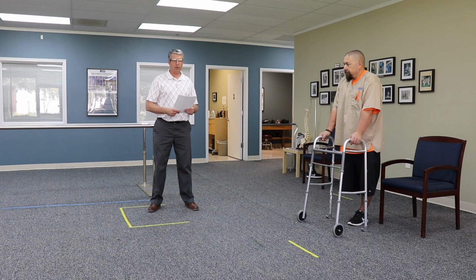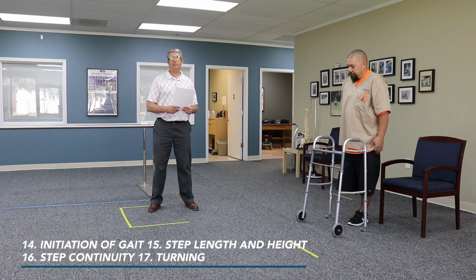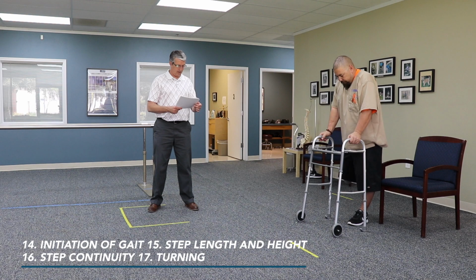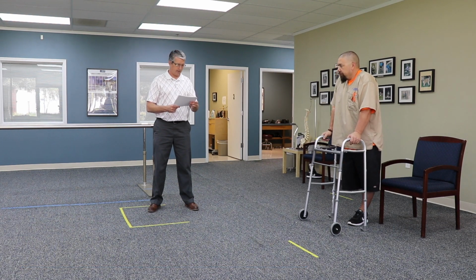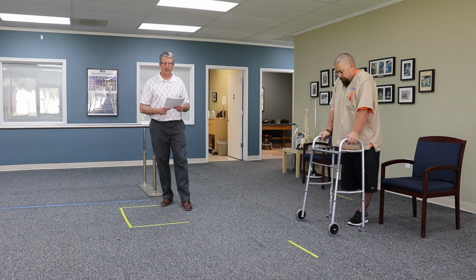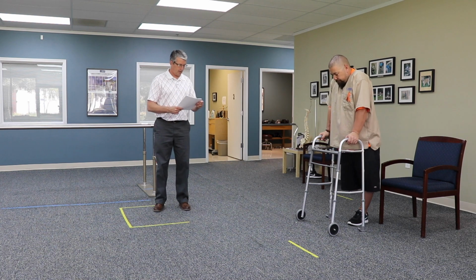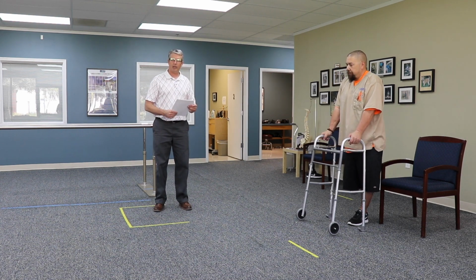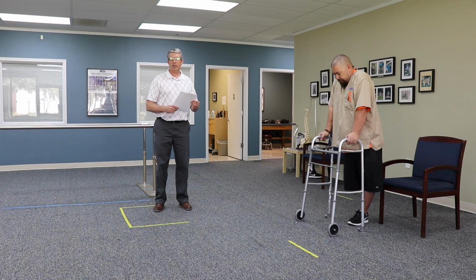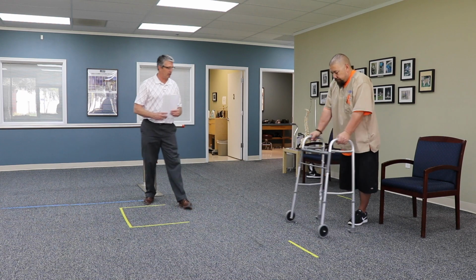Okay, we're now at that point where we're going to get the initiation of gait going. So that's number 14, 15, 16, 17 on the list of tasks. So initiation of gait. Yes, you can do this test without a prosthesis on. Obviously, they're going to need an assistive device, but they can still do it. So if they feel comfortable and the patient's confident in being able to try it, I say do it. So I'm going to ask the patient to begin walking, and I'm going to be looking at their step length and step height, the step continuity, and then their ability to turn around and come back. Okay, so go ahead, Jay, start going.